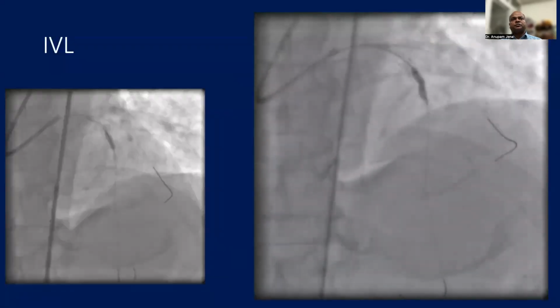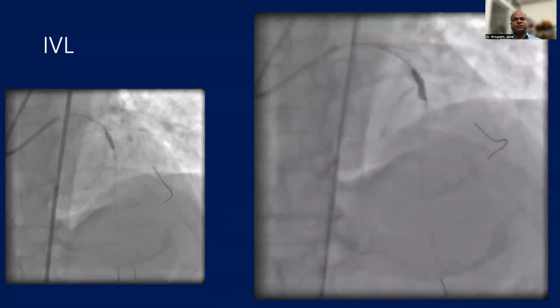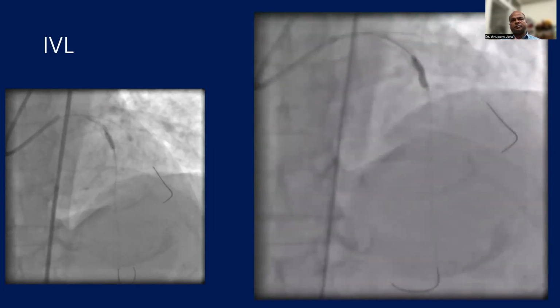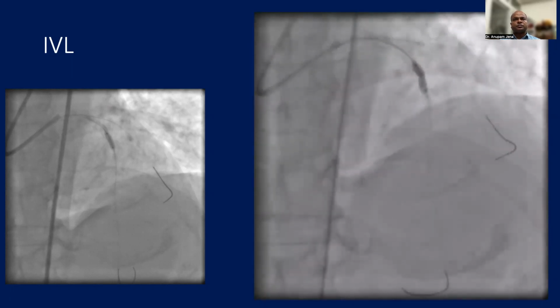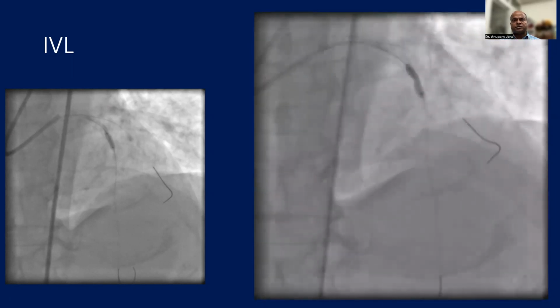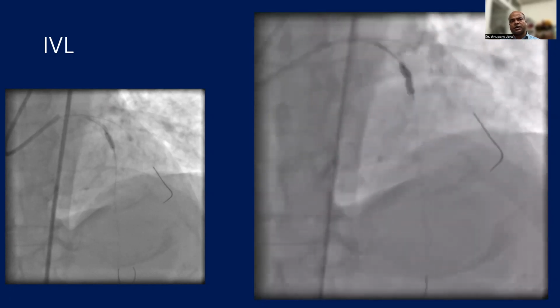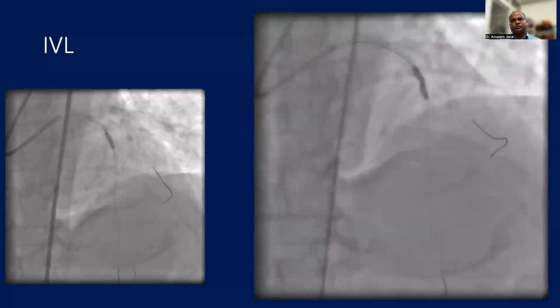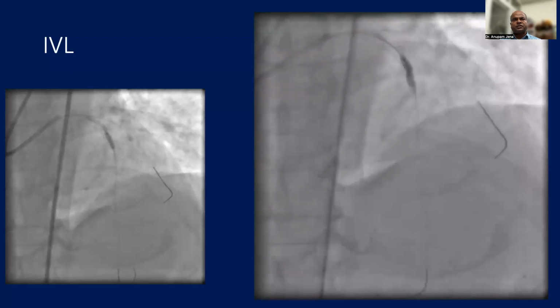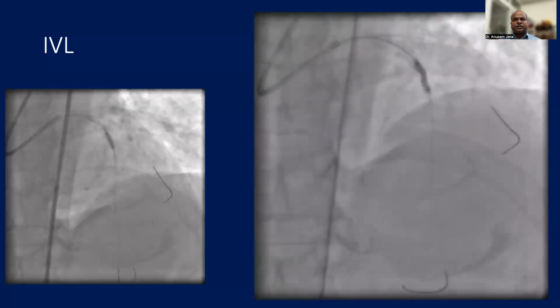So once we have decided to go ahead with percutaneous coronary stenting, what is the strategy that we should follow? As you have seen, in left main cases the double kissing crush technique has shown superior long-term results compared to other techniques. In this case, because of the severe calcium and complex anatomy, we decided to go with an upfront two-stent strategy. Naturally, the question comes whether one-stent provisional stenting is okay, or you should go upfront with a two-stent strategy.